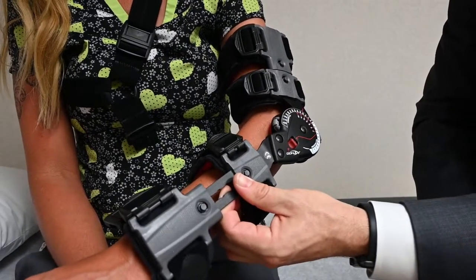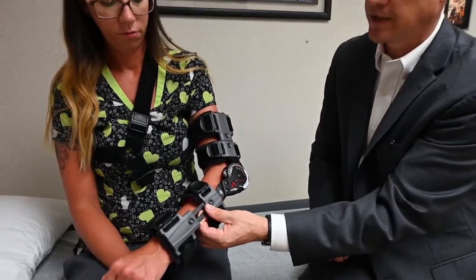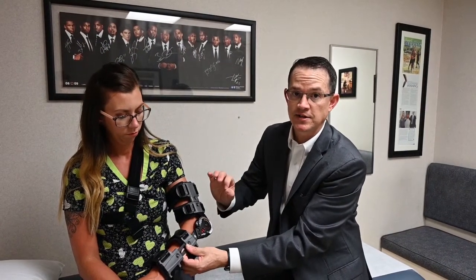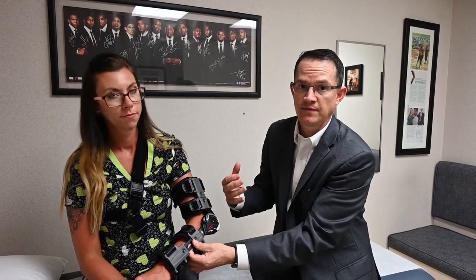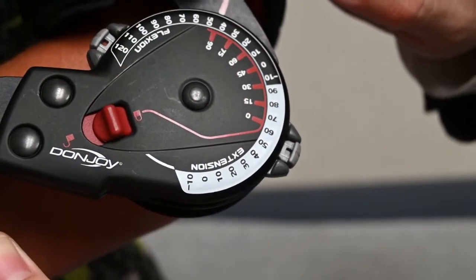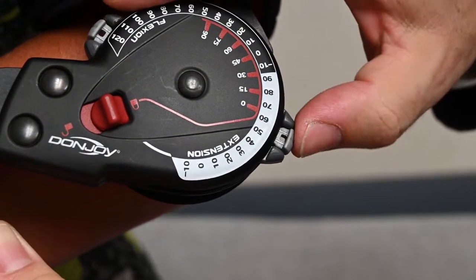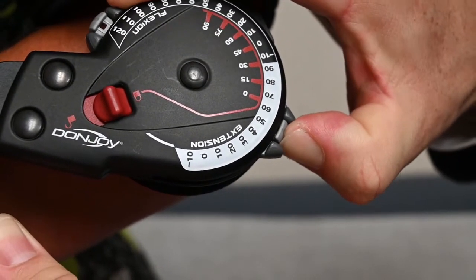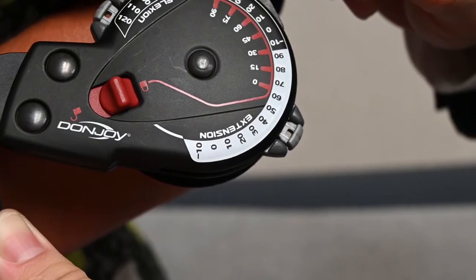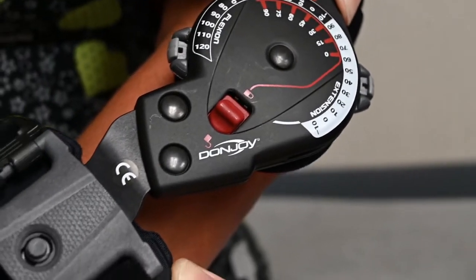The starting position for your brace is largely determined by how stiff your elbow was at the time of your reconstruction. We then have patients change their extension by 10 degrees at a time, with the goal being to have the elbow all the way out straight by three weeks post-op. In order to change the dial from 60 degrees of extension down to 50, therefore giving you an extra 10 degrees of extension, you simply push the dial and move the controller one position down and it will then pop into place. This will allow for greater range of motion or greater extension.